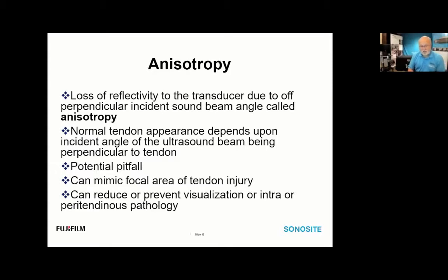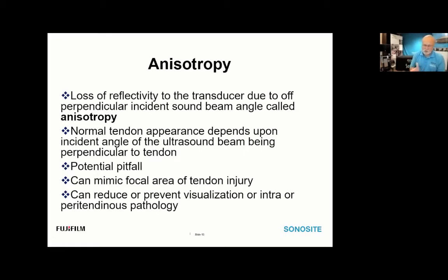Anisotropy is the loss of reflectivity to the transducer due to an off-perpendicular incident sound beam angle. Normal tendon appearance depends on the incident angle being roughly perpendicular to the tendon so echoes reflect back to the transducer. In an off-perpendicular beam, it's like shining a flashlight into a mirror at an angle — it doesn't come back to you. The angle of incidence equals the angle of reflection.